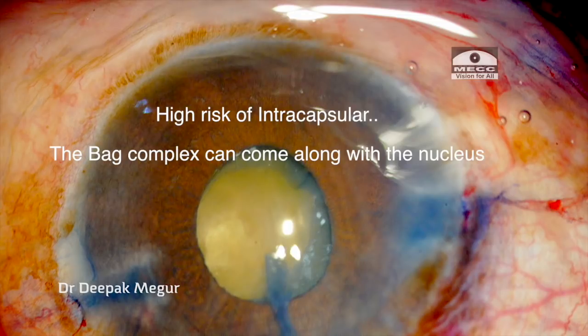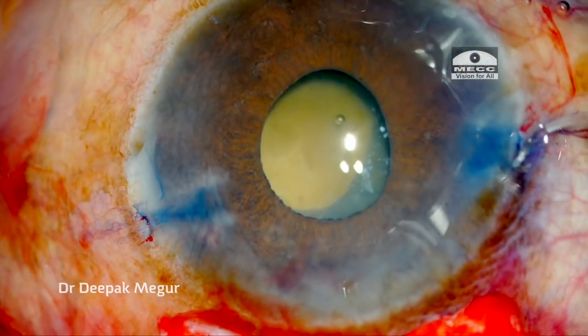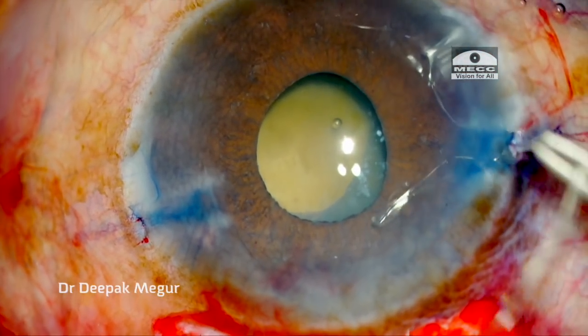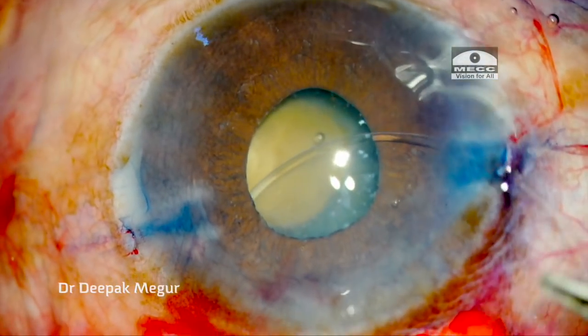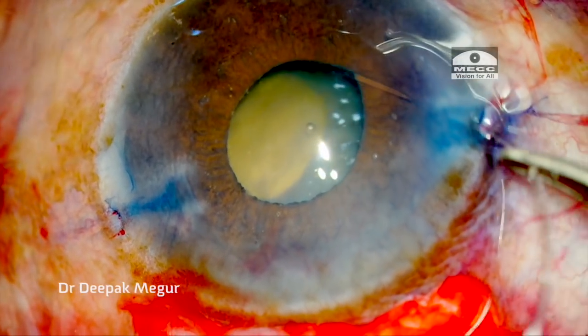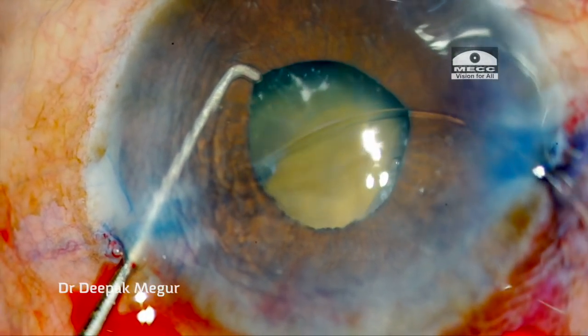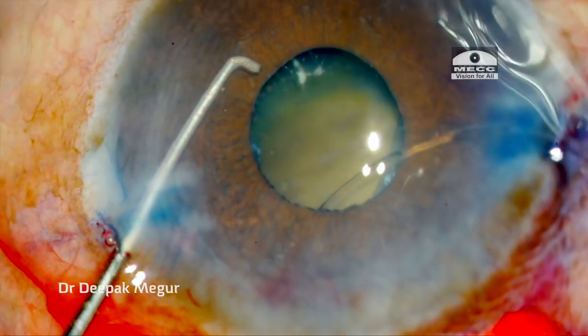This case carries a very high risk of intracapsular extraction because the bag complex was going to come along with the nucleus. So I needed to enlarge the CCC desperately, but before that the bag needed to be stabilized by CTR. Because this was a SICS case I thought I would manage without using an iris hook, but I am finding it difficult to negotiate the ring into the bag — it has gone above the bag and under the iris. This could have been easily prevented if I had used iris hooks from the start.